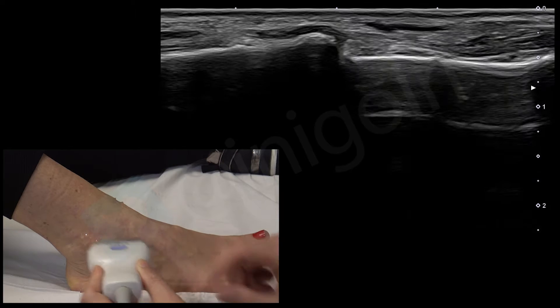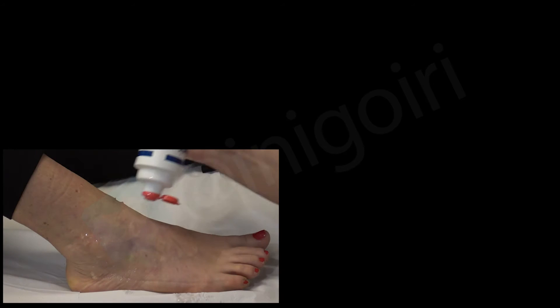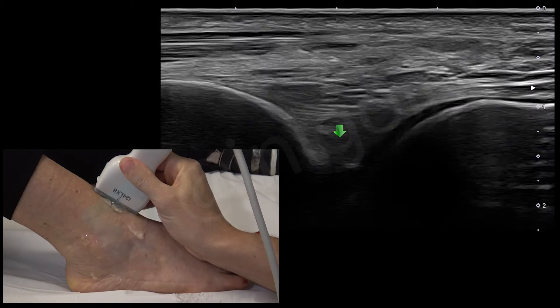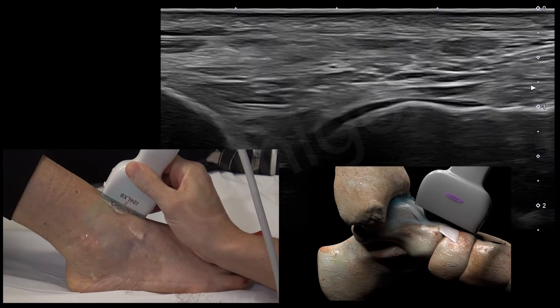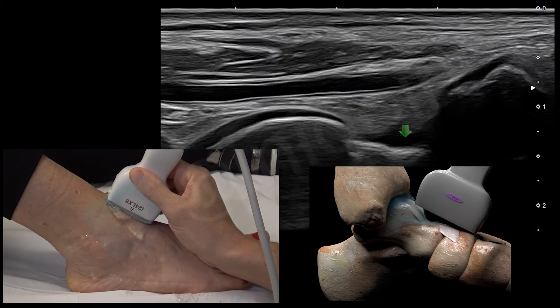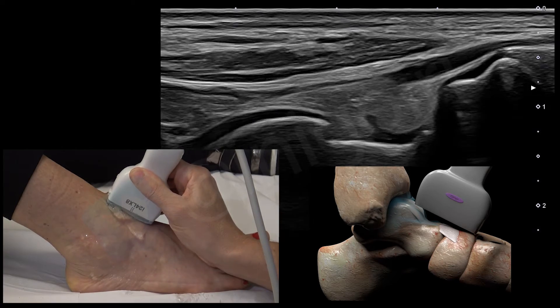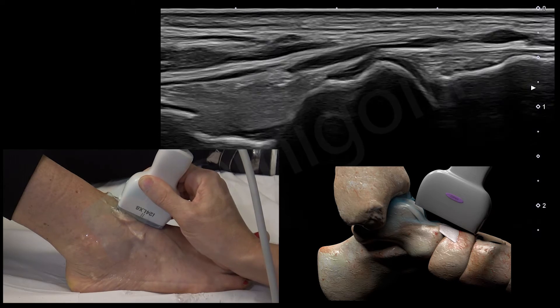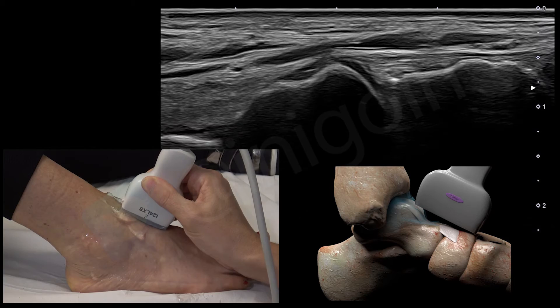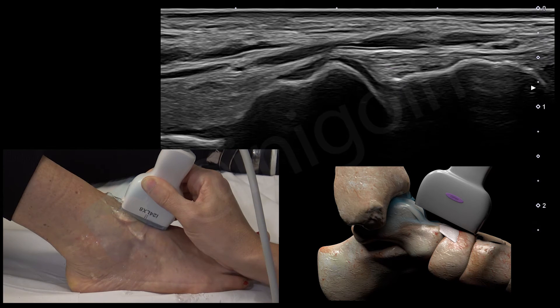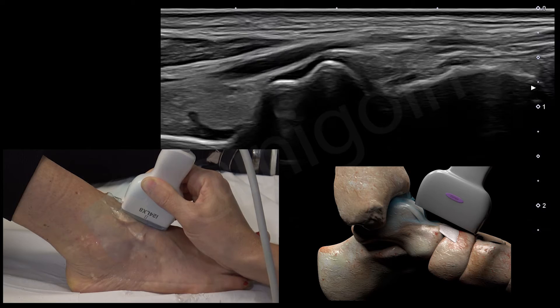Now we are going to check the anterior recess and the talonavicular ligament. We start at the distal tibia — this is the joint between the tibia and the talus, this is the body of the talus, and the neck of the talus. Here we will check the anterior recess; if there is an effusion, you will see the fat rejected superficially. And the head of the talus and the navicular bone — between these two bones there is the talonavicular ligament, very long and with this fascicular pattern.